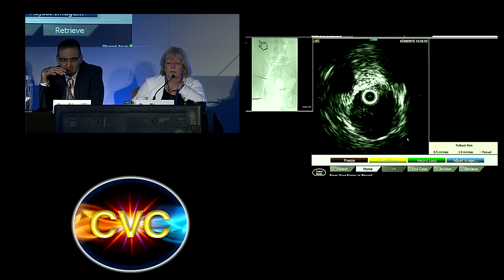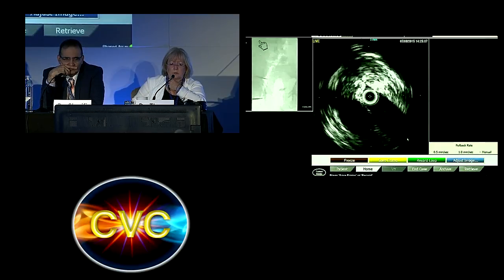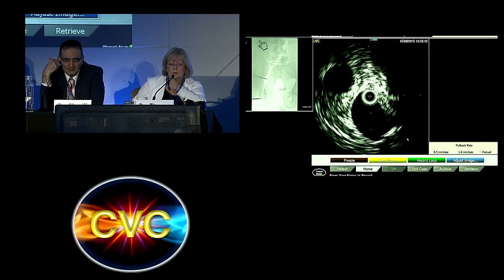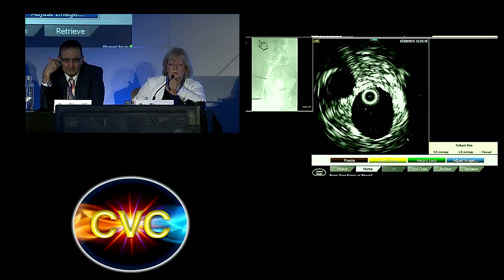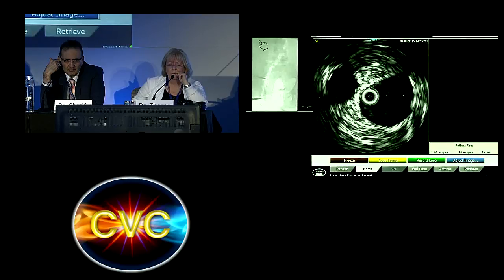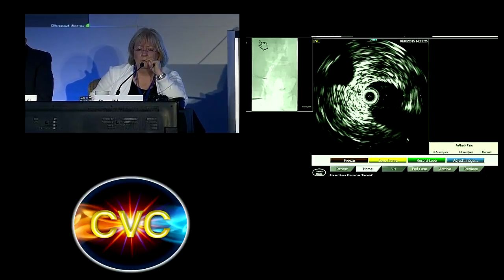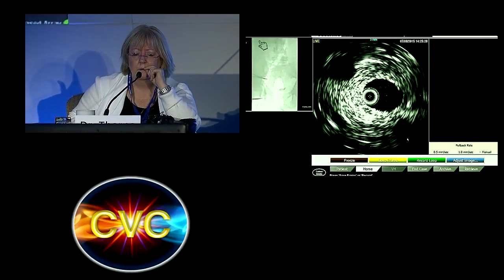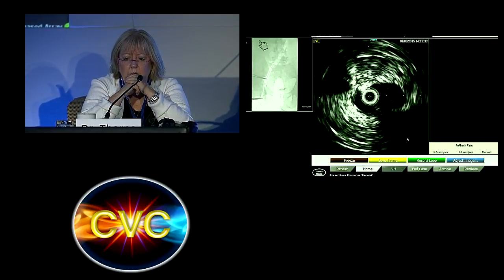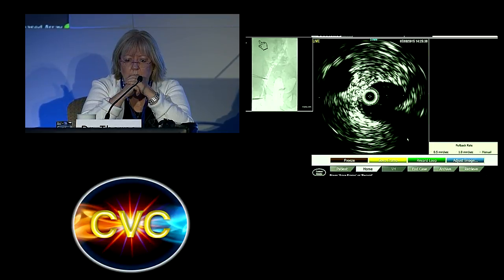All right, let me just run this IVUS one more time. So here we go again. Fellows with the common iliac coming down. We're going to the place that I just angioplastied right now. See, there's some stuff in the vein right there. It's just a transition, right? The transition is just right at the hypogastric. You see, this is the hypo right there. It looks very big. Suddenly, it comes into the size of the external.